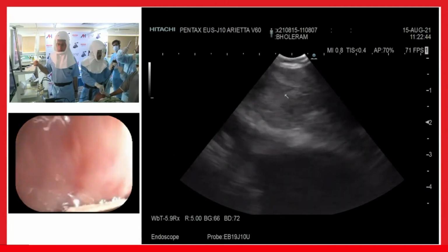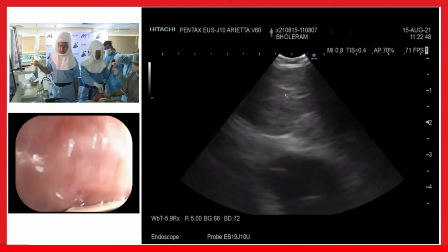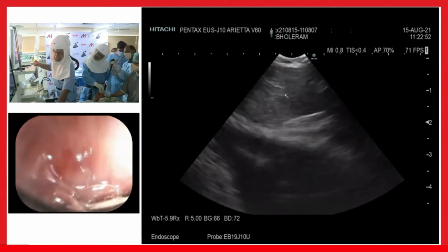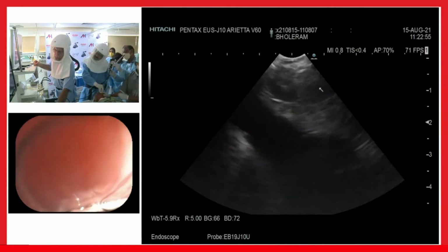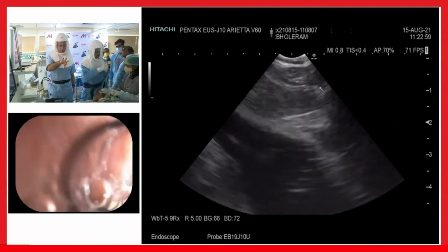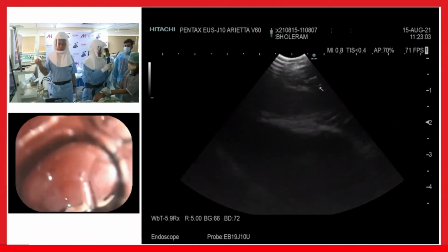You can go into the right bronchus, you can go into the left bronchus, and you can see the subcarinal node. There are vessels beyond this, but this is the subcarinal node you want. So when you go into the right bronchus, rotate anti-clockwise. When you go into the left bronchus, rotate clockwise.